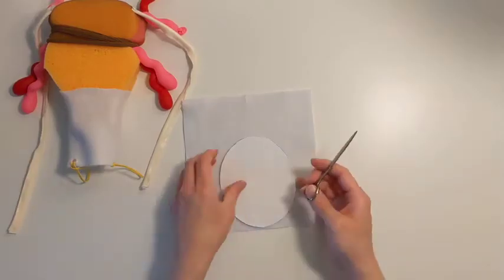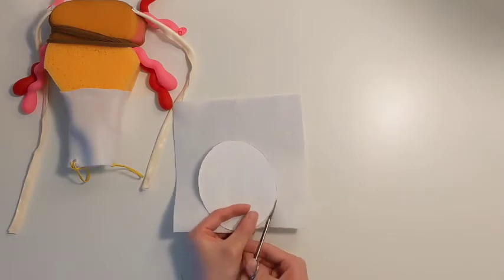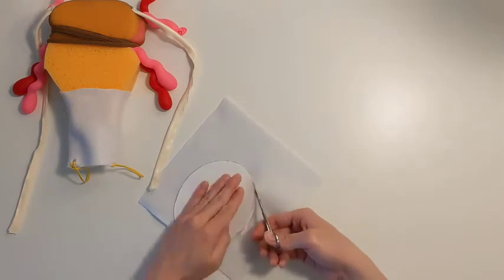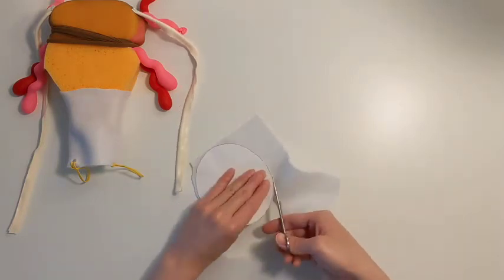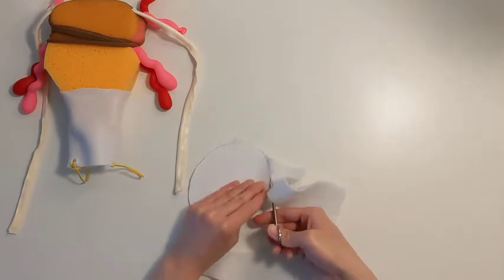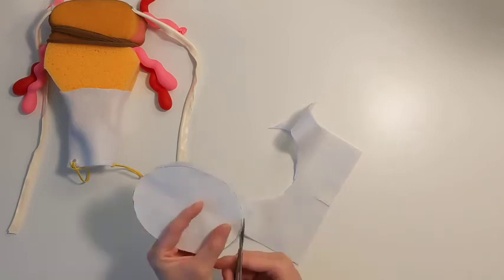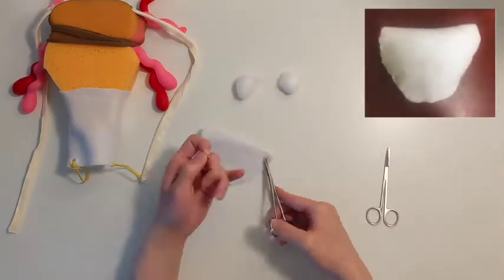The bladder will also be made from white felt. Cut a piece of felt using an oval stencil approximately 13.5 by 11 centimeters. Then fold the felt in half widthwise. Similar to the vagina, attach the edges together using suture, needle and thread, or staples. You can suture the bladder the same way the vagina was sutured. For example, consider tying an anchor and then suturing a running stitch.